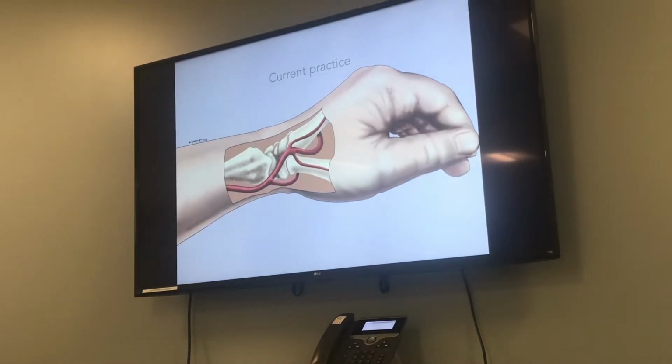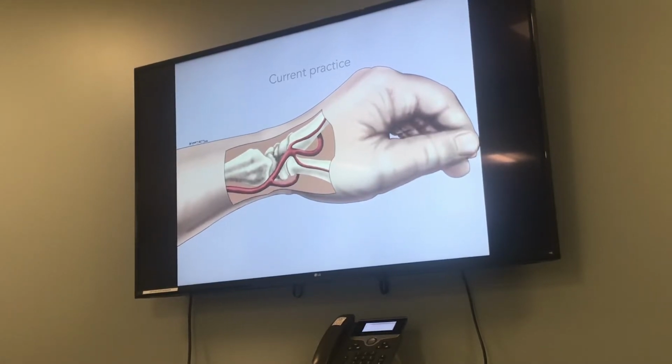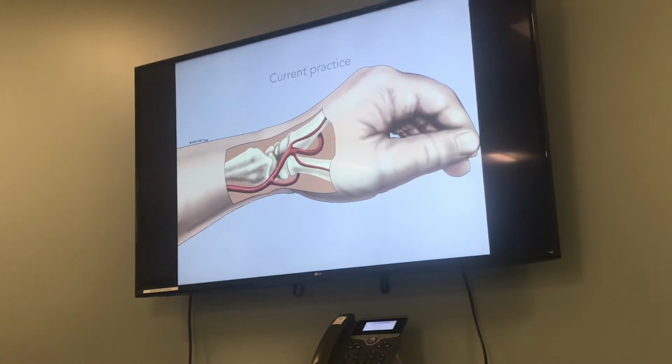The thing that you probably noticed in the last year and a half, maybe 2 years, is that some patients, not all, come up to 1S with the hemostatic device in their snuff box rather than their wrist. Myself and a few of my colleagues changed a few years ago to working from the snuff box because it's a lot more comfortable for the patients, and as you've seen in the post-procedure orders, the time to get hemostasis is way faster. When you puncture through the snuff box, the hemostasis time is 10 minutes. Conventional radial is 25.